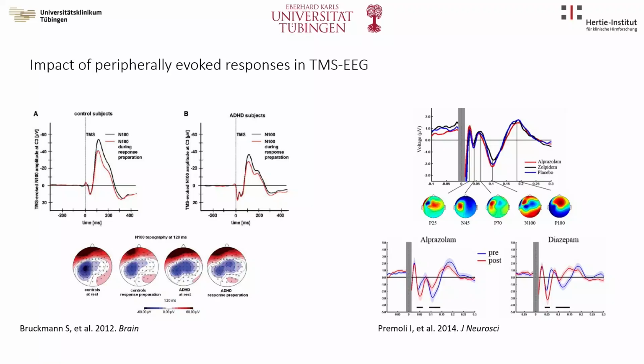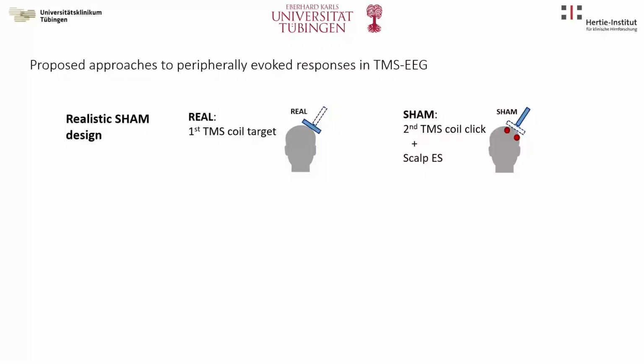So this is complicated, and this definitely requires action to disentangle these two responses, the response from peripherally evoked potentials and real TMS evoked potentials. So typically this has been tackled like this.